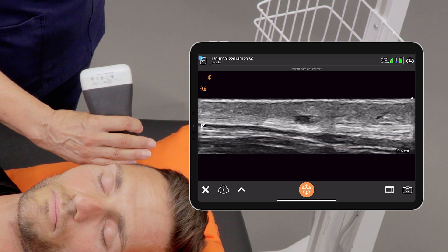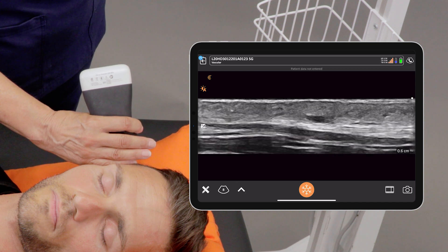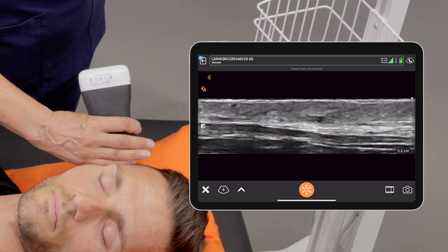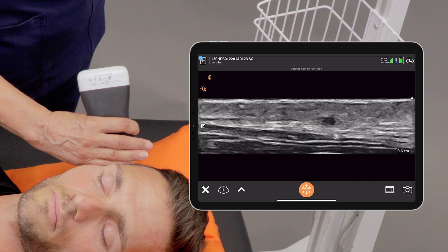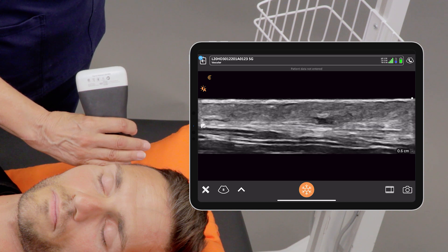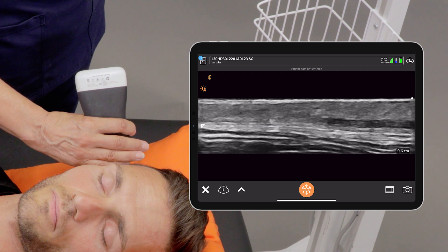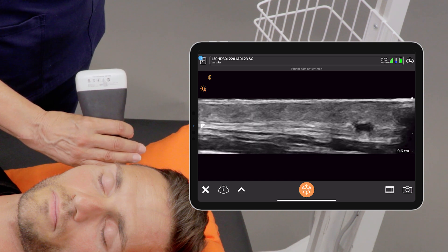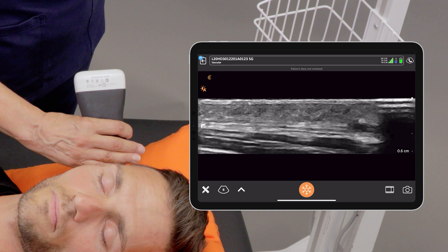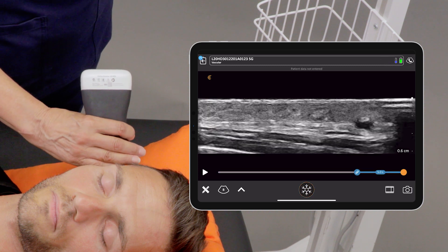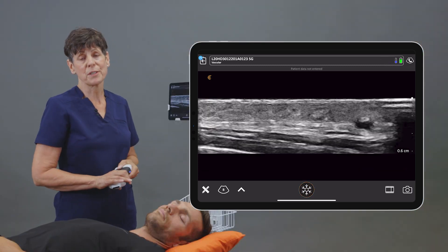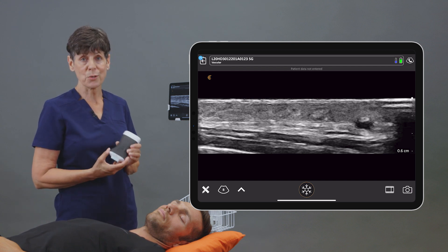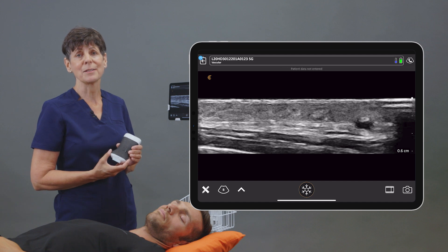In real time I can trace that vessel, not only looking in one point but scanning a very large section of the vessel in order to come to a more definitive diagnosis. As you can see, the L20 is a great choice for interrogating the temporal artery.